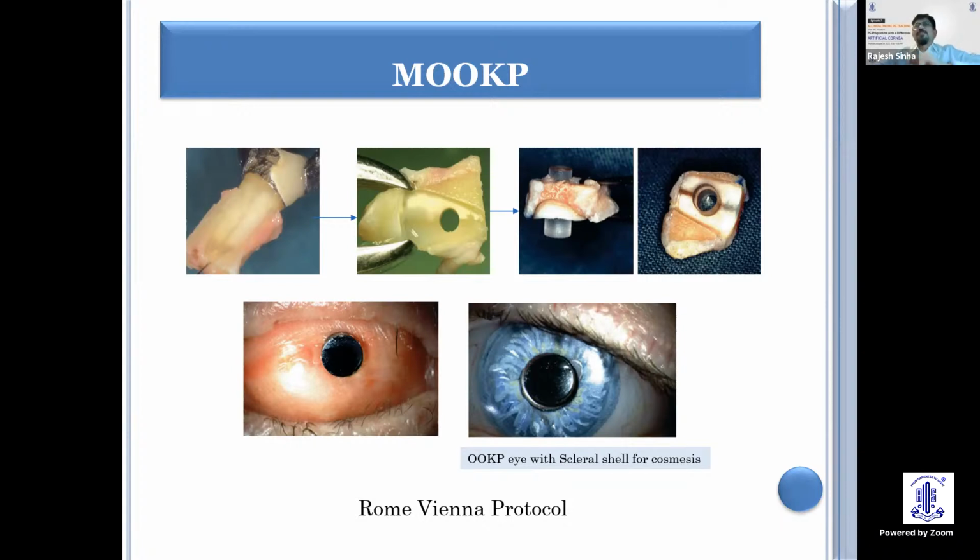And then after that, you put a donor cornea, suture it, and since it's a dry cornea, you have to put some conjunctival layer over it, and then you take a mucosal graft to make it wet. So you take buccal mucosa close to about 2.5 to 3 centimeters, and you cover it up, you anchor it with recti sutures, and then you cover it up, and then take a canine tooth, extract it, and then fashion it to create a lamina, drill a hole in it, 3 mm diameter, put the PMMA cylinder and insert it in a subcutaneous area in the opposite cheek.